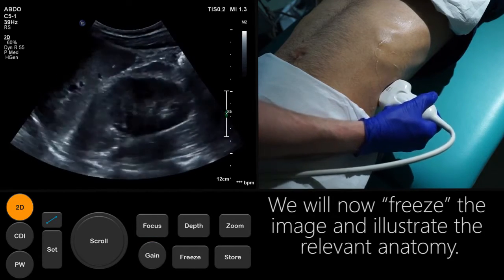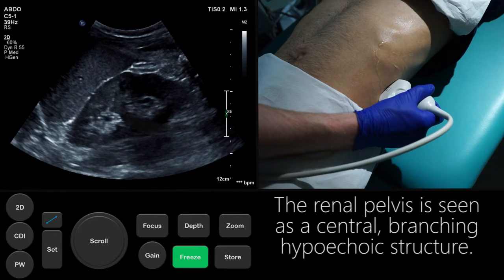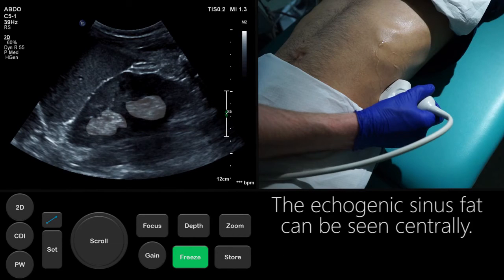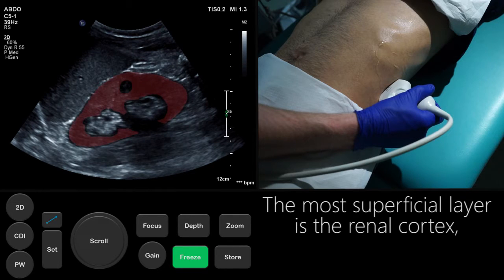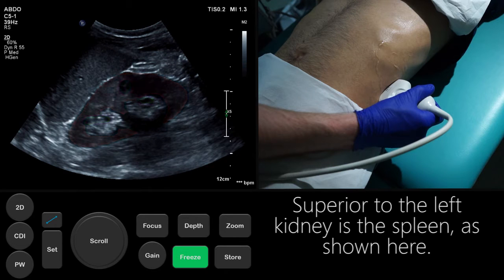We will now freeze the image and illustrate the relevant anatomy. The renal pelvis is seen as a central, branching hypoechoic structure. The echogenic sinus fat can be seen centrally. The most superficial layer is the renal cortex, within which the medullary pyramids are seen. Superior to the left kidney is the spleen, as shown here.